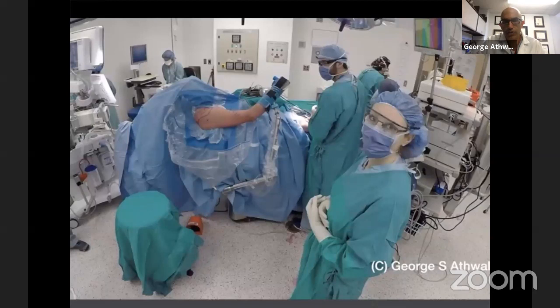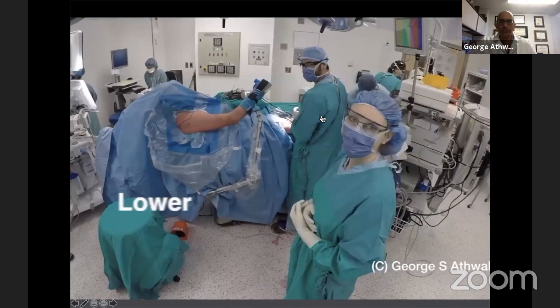And so this is the setup for surgery. Beach chair positioning, articulated arm positioner, access to the medial border of the scapula. And here's my fellow, who has already started to harvest the semitendinosus on the ipsilateral knee. So we'll get started with the video. This is my other fellow, Christy, who is going to help out.